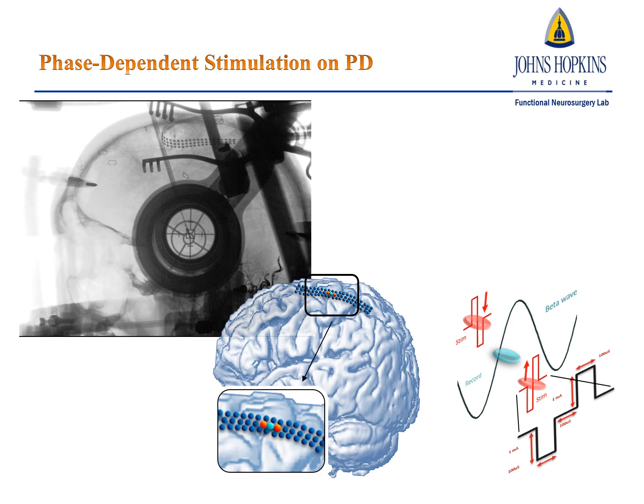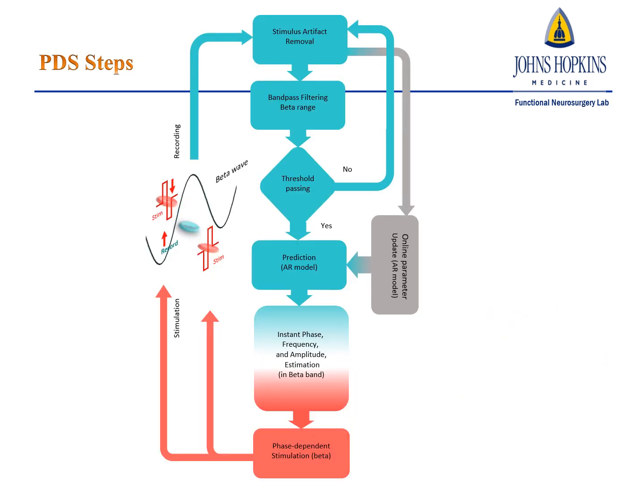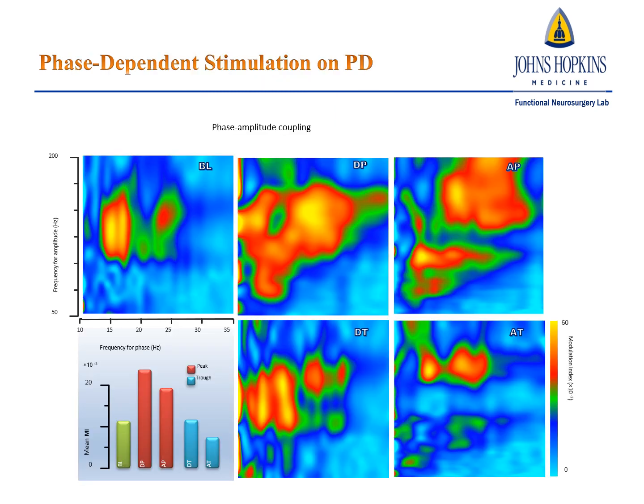Our intraoperative studies provide a unique environment for performing these recordings, including our ability to pass subdural strips through the burr hole used for deep brain stimulation cases, and then apply stimulation pulses to primary motor cortex during testing episodes. We use an autoregressive modeling algorithm running on a processor to forward predict when the stimulation pulses should happen. And we focus on phase amplitude coupling metrics to verify that we can selectively modulate this biomarker, including with trough timed stimulation pulses relative to beta rhythmic activity. We can reduce the PAC modulation index, and with peak time pulses, we can selectively increase.